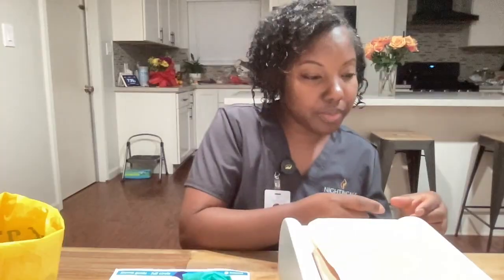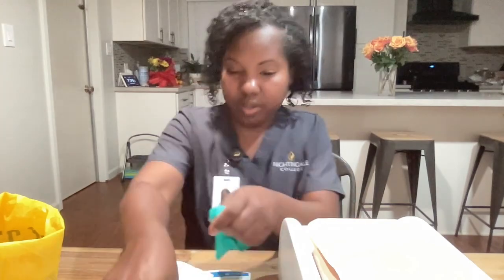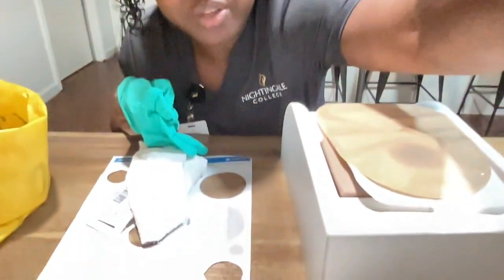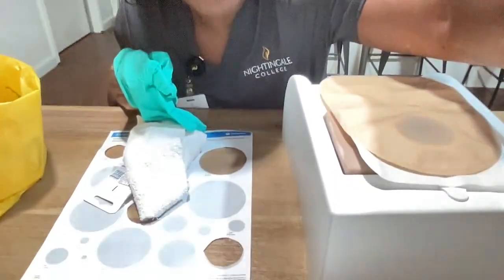Hello, my name is Michelle and I'll be your nurse today. Can I please have your name and your date of birth? I have verified their information with their wristband. Ms. Jones, today I will be removing your current colostomy bag, I will clean your stoma, and apply a new bag. Do I have your permission to proceed? I will put on clean gloves, and for the purposes of the next part of the video, I'm going to bring my camera down so that you can see the bag clearly.